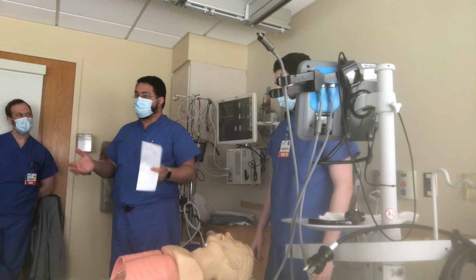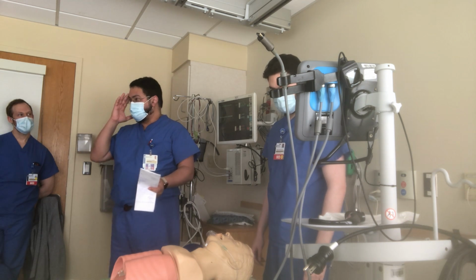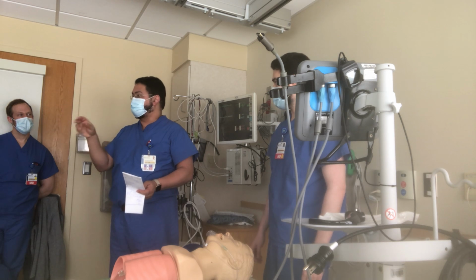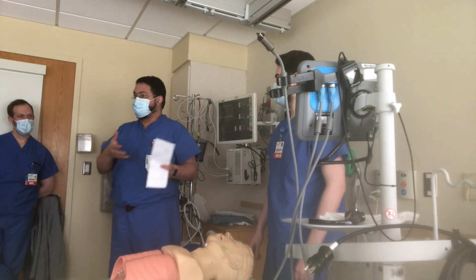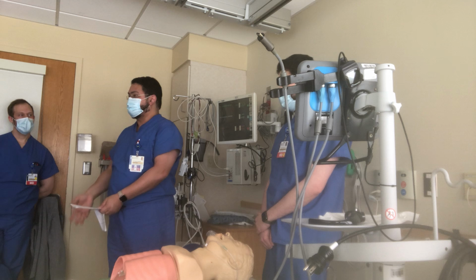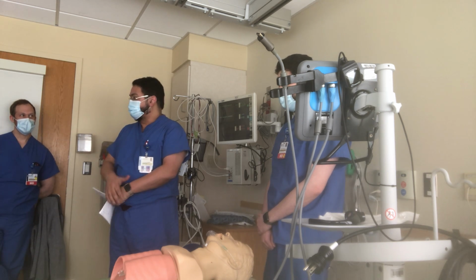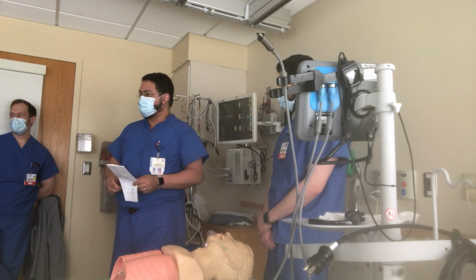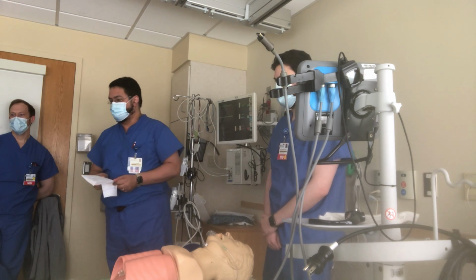Anyway, you're gonna crack the patient because if you think about it, that's not too aggressive, by the way. There's vomiting in the airway. That's a disaster waiting to happen. The saturation is 85%. You know he's a difficult intubation and difficult ventilation. What are you trying to do here? You're gonna take 10 minutes to intubate him? You're not gonna. So crike. Let's get the needle crike.